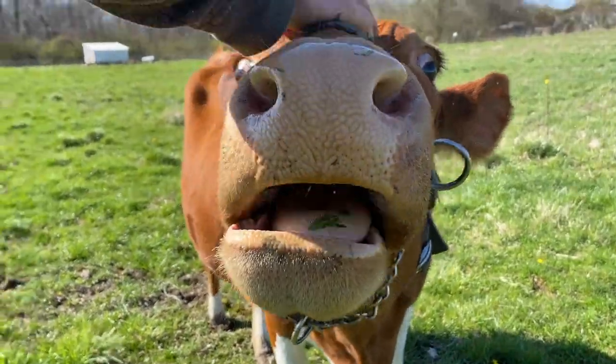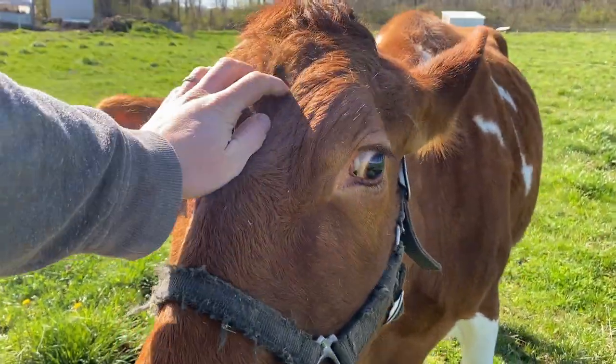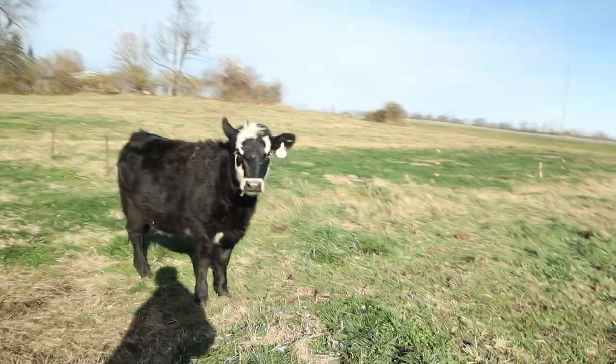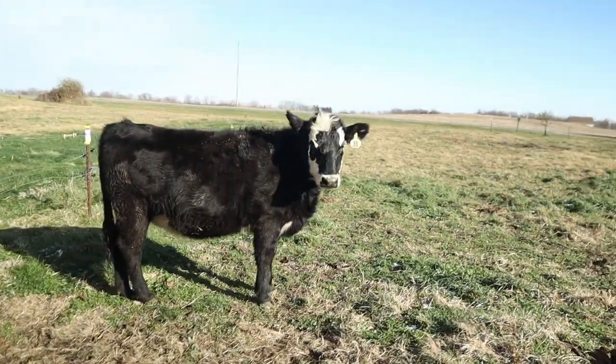Since these tests are only reliable about four weeks after breeding, if we test her now — about a month after the first breeding — and she tests positive, that means she was pregnant the first time. If she tests negative, that means she's not pregnant from that first time, but she could still possibly be pregnant from the second time I got her bred.